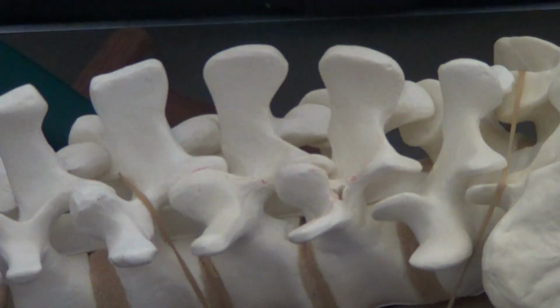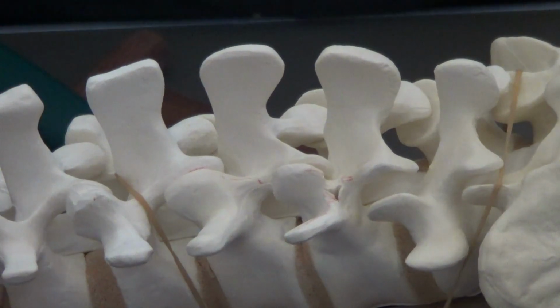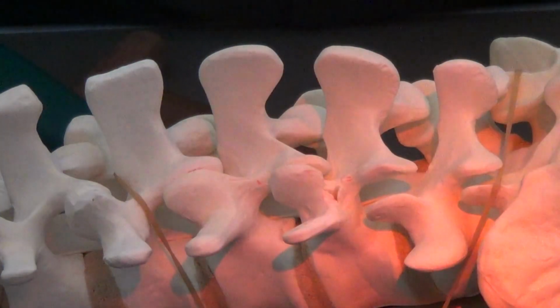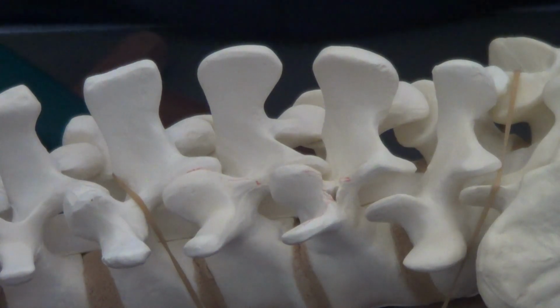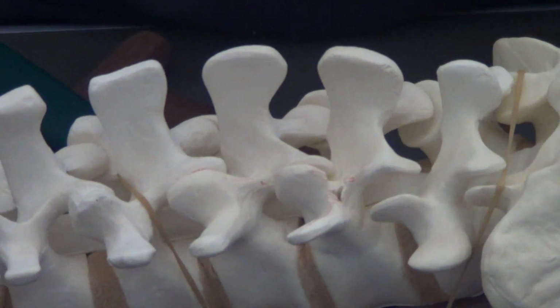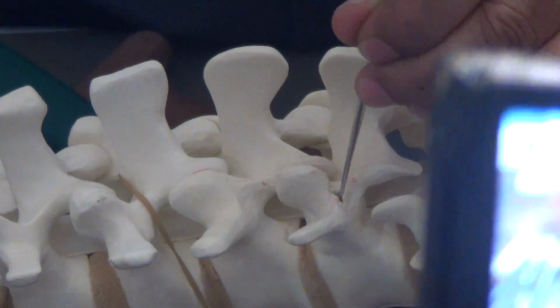This is about 10 millimeters. So that's half the pedicle. So you must always sound. Where's the sound? Use this as a sound. This usually at the tip has a sound there. So you go inside and try and feel your walls.